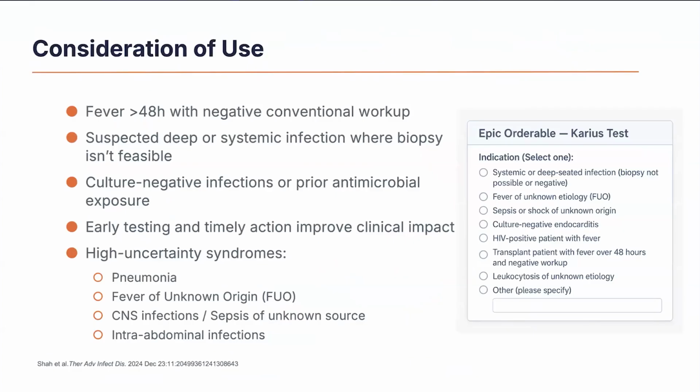All right, so before we end our presentation, we wanted to go over some take-home points that once you leave the webinar and you see your next patient with infection and transplant, what scenarios you should consider sending a Karius test, because this is the high risk situation and your pretest probability of finding something in Karius is higher.